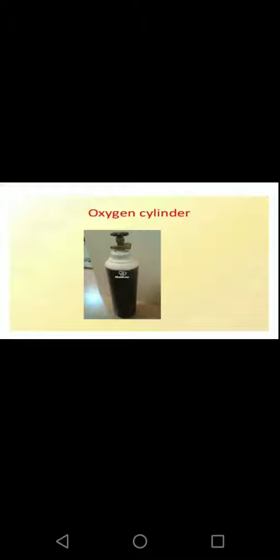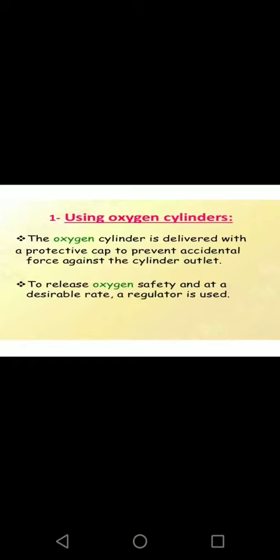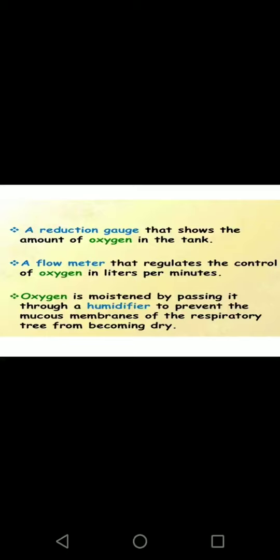Sources of oxygen include the oxygen cylinder and wall outlets. Oxygen cylinders are delivered with a protective cap to prevent accidental force against the outlet and to prevent leakage. A regulator controls how much oxygen is delivered to the patient, and you set it to the desired amount.